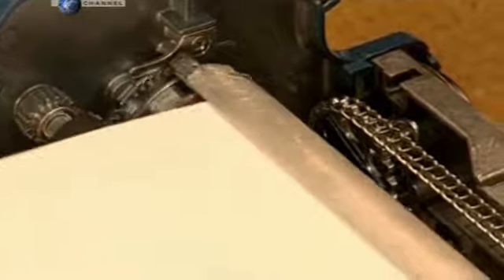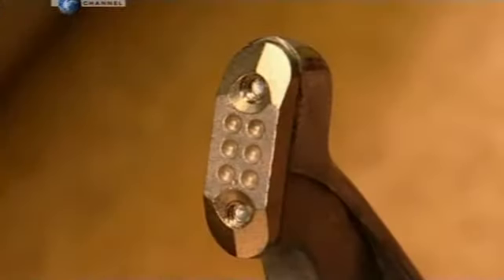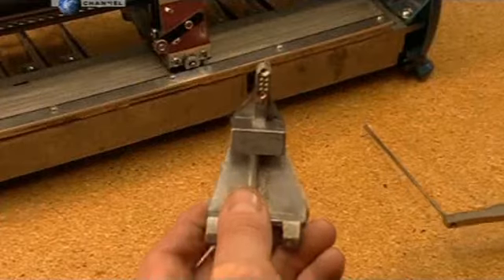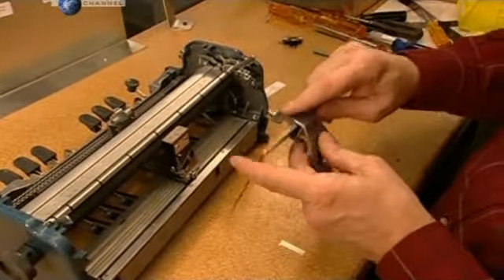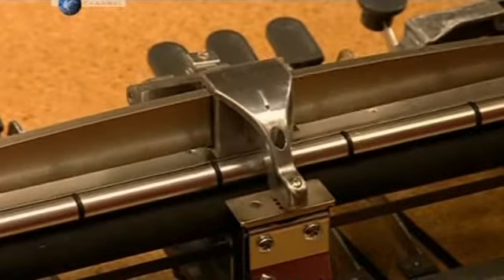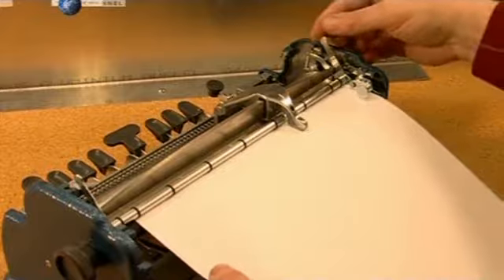There's still one more paper feed component to install, the pressure roller. It holds the sheet of paper against the feed tube. Now the die is screwed to the carriage top and installed on a support beam. Then this assembly is positioned over the stripper plate at the top of the carriage. The paper hold tension is checked and adjusted.